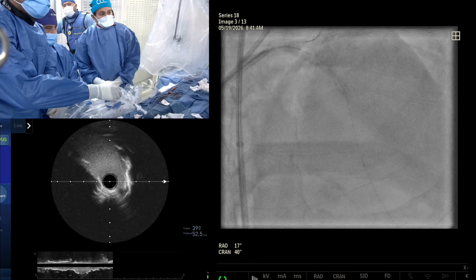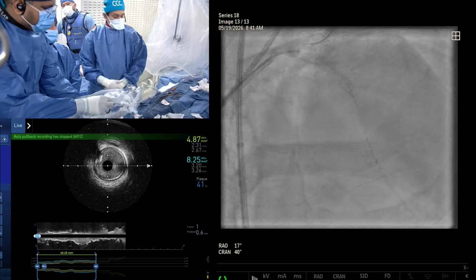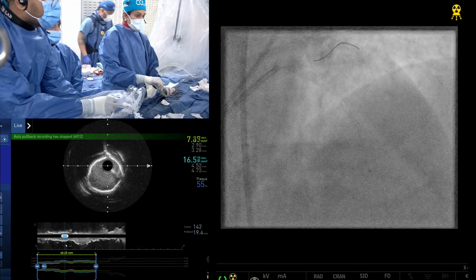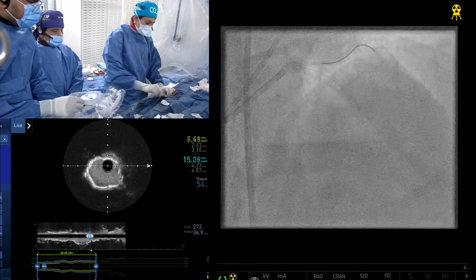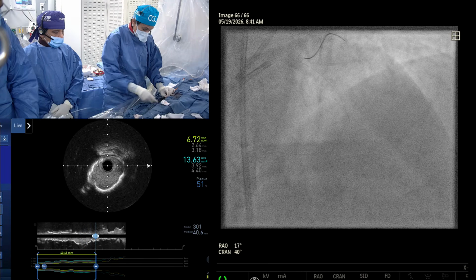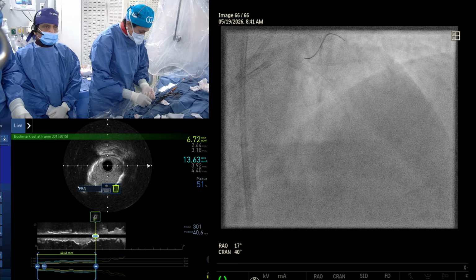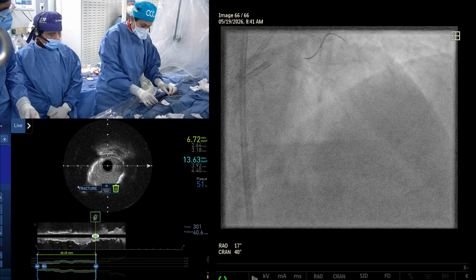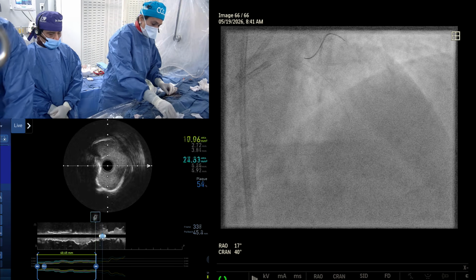That exact question has not been studied yet. We actually are doing our own trial, Nodule Shock, to understand whether you have to give the entire set of pulses, because the original teaching was that if the dog bone effect is gone, then there is no need to give all the pulses. But the question is whether it is operator determined or you have to give 120.